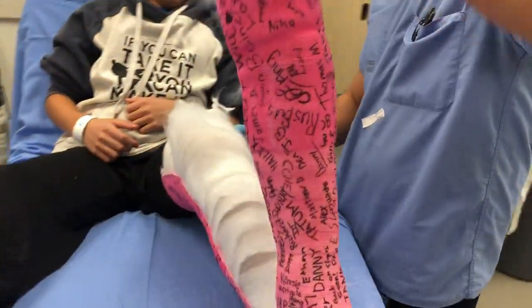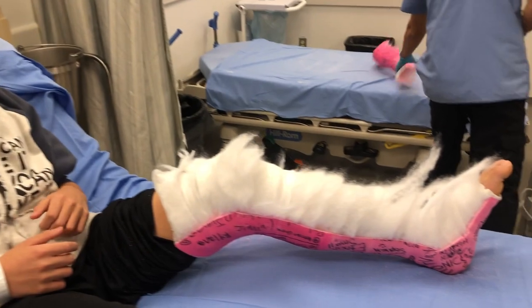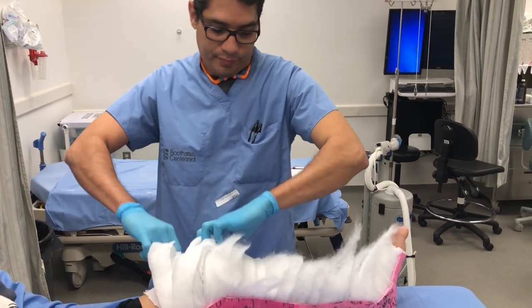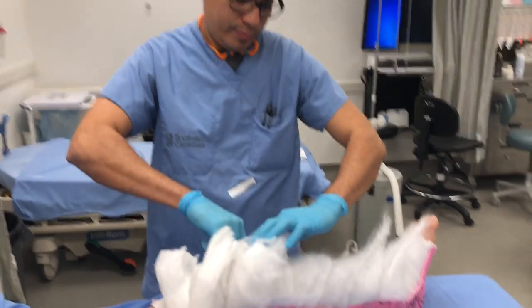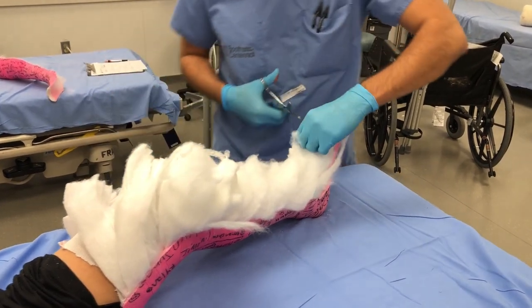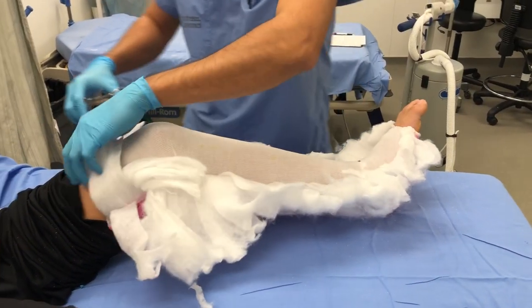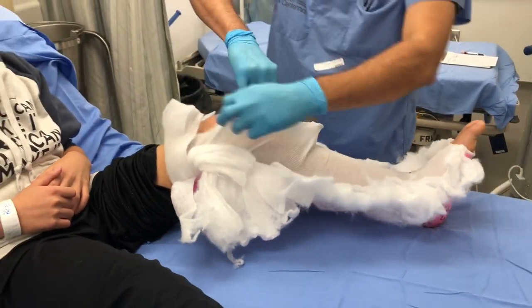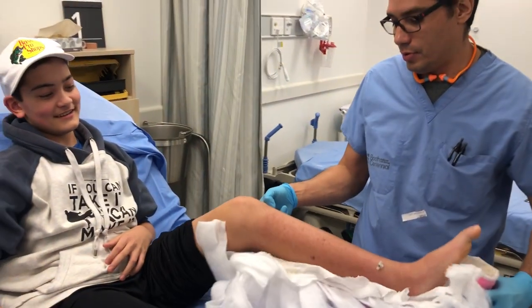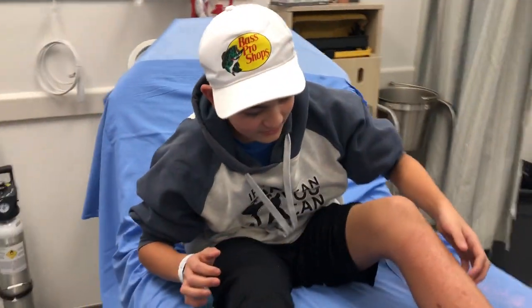There you are, so now this part can come out. Awesome. What's the first thing you're going to do — scratch? Yeah! Now we cut this part here. There you are — and then freedom! Oh my gosh. There you are, that feels nice. Perfect. Awesome. Oh my gosh. Thank you very much for letting us film that.